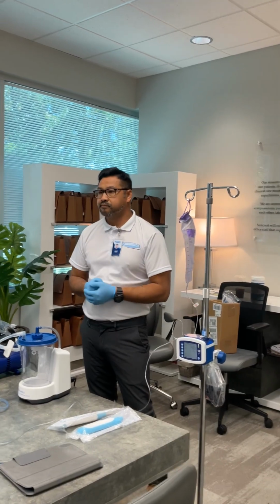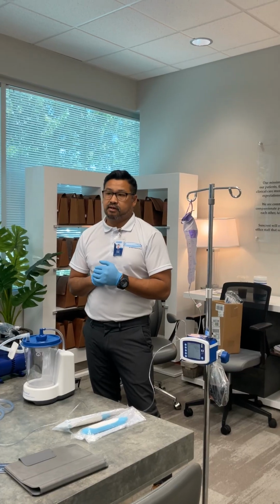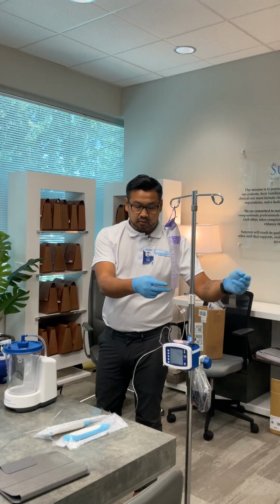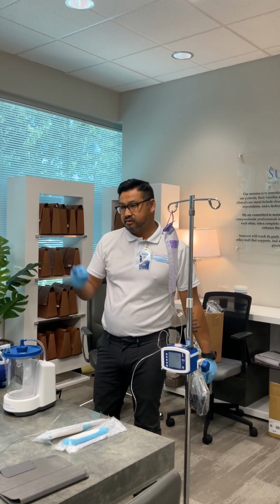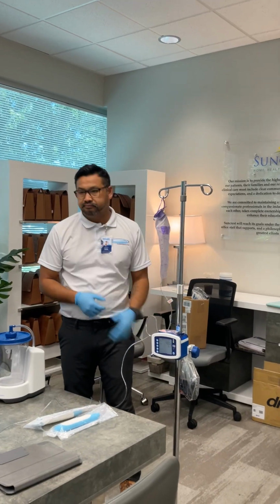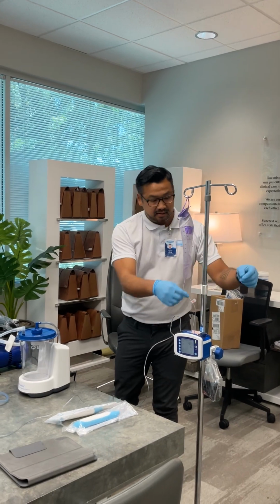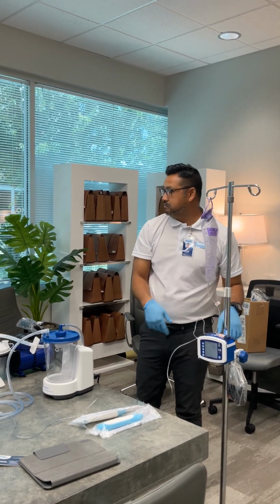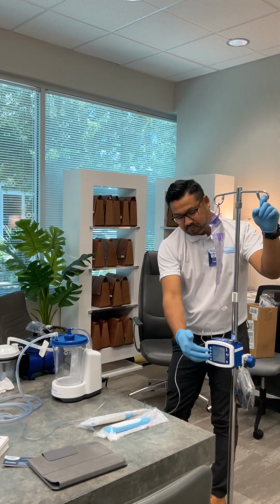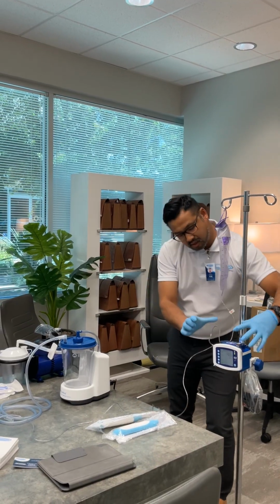Do you also carry the bags that are dual, that have the water? No, we don't. This one does not have that feature where you can draw from two different bags, because I know you're talking about one's water, one's formula. So this is just formula, and it then has to flush on its own. There is a feature on here, but you have to switch bags and switch the tubing back and forth. That's so that you can hang one water and then program it in, but you'd have to swap it out. The other ones are a little bit bigger and have two.